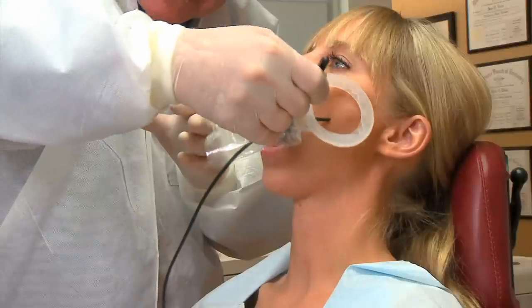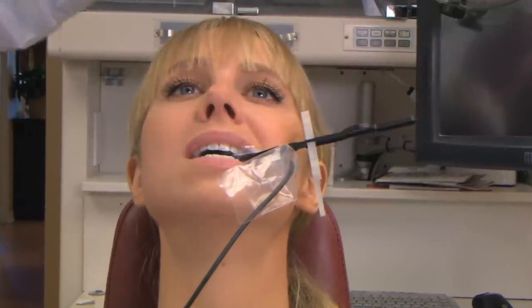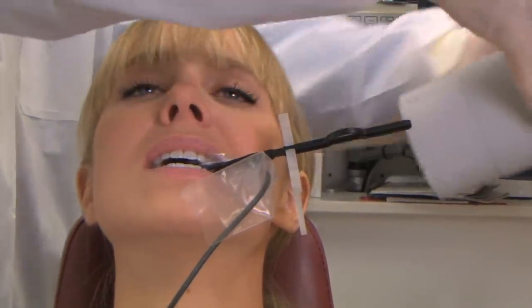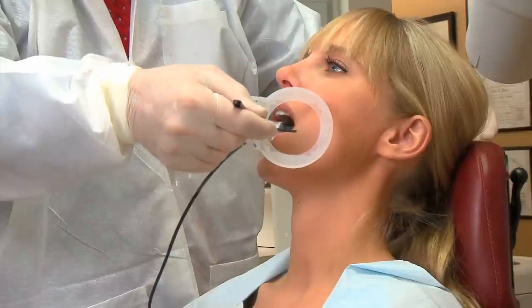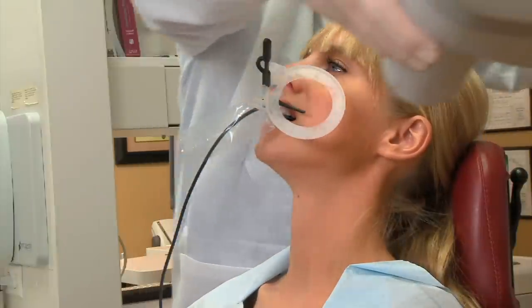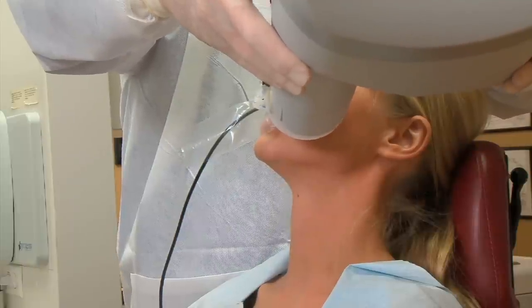Go in at a 45-degree angle, turn, push and close. Position the cone and take the image. Slide forward for the premolar position, close and capture. Now you have all four of your bite wing positions without any change at all in the holder setup.